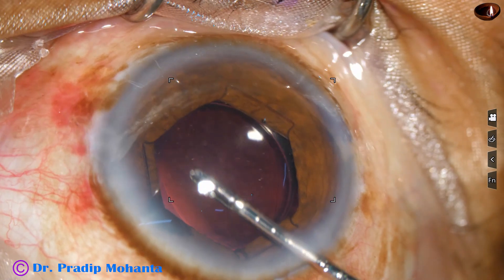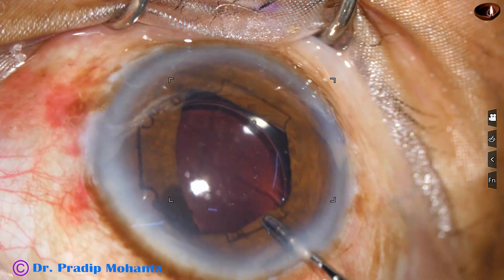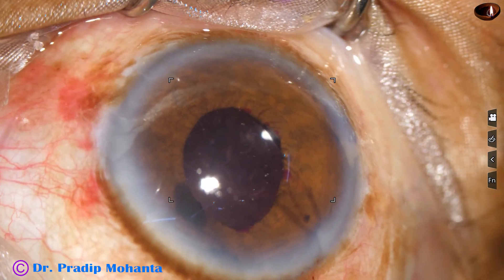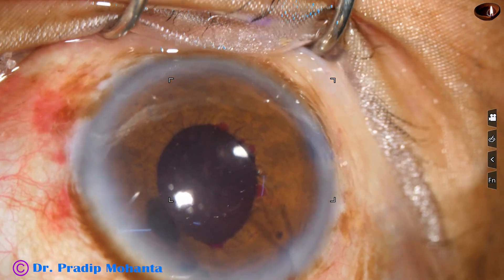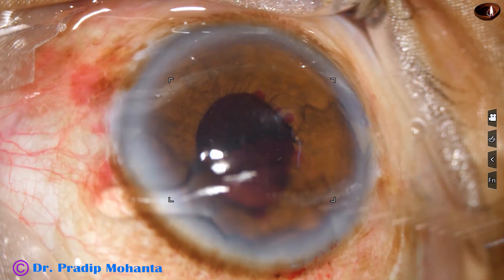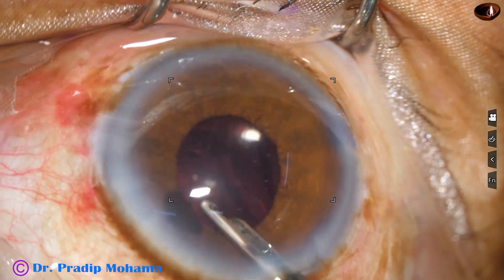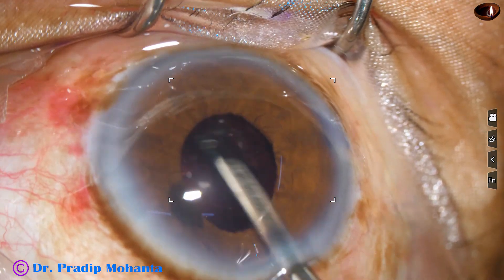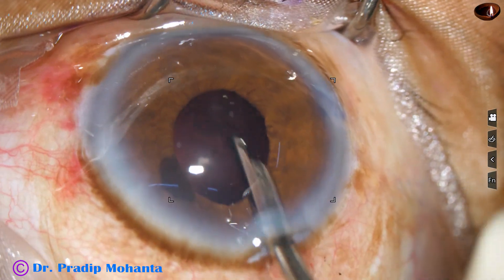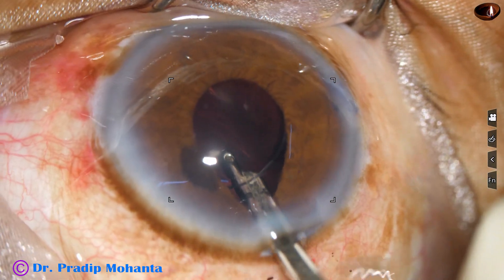So I go to the three o'clock flange, hold it, pull it centrally, disengage all the flanges, and pull it out. The beauty of this device is you just need a forceps — it is known as a 23-gauge B-Hex forceps. You don't need any injector. By the same forceps you can easily place the pupil expansion device as well as remove it.